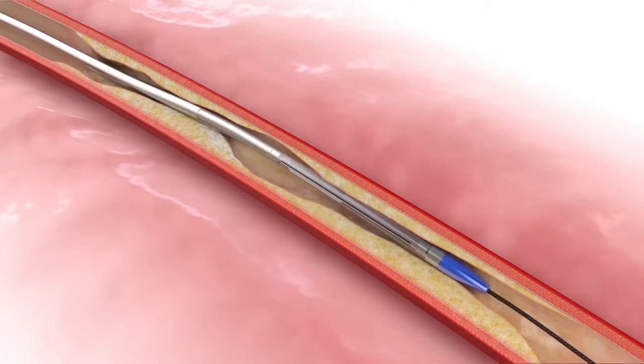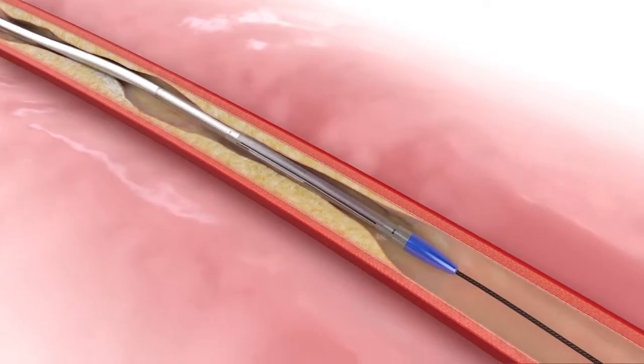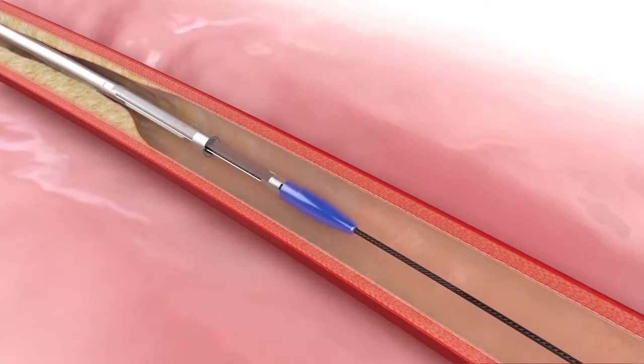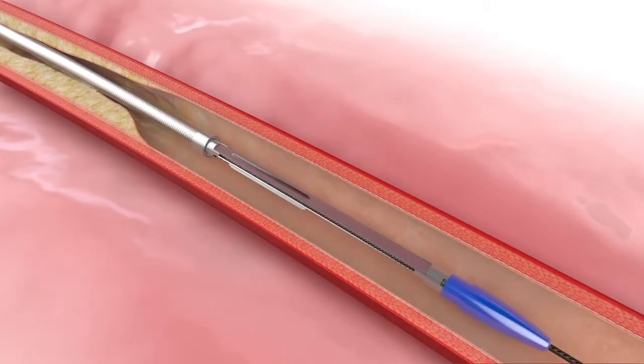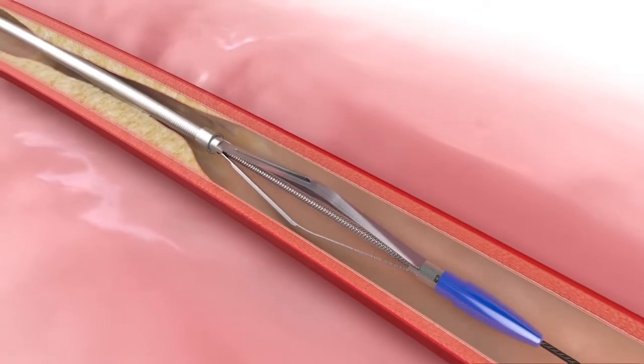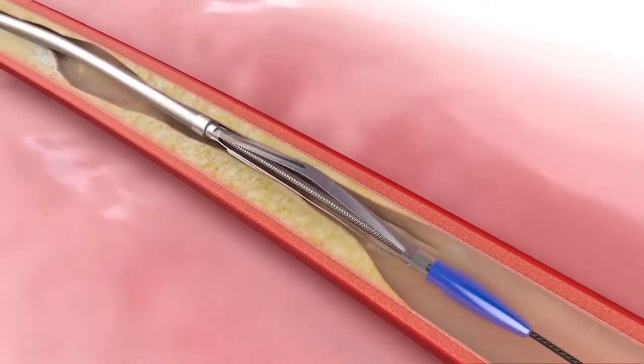Advance Flex through the area to be treated. Expose the distal vessel prep element by pulling back on the sheath actuator. Pull back the element actuator to expand the vessel prep element. The vessel prep element will expand up to 5.5 mm in diameter.